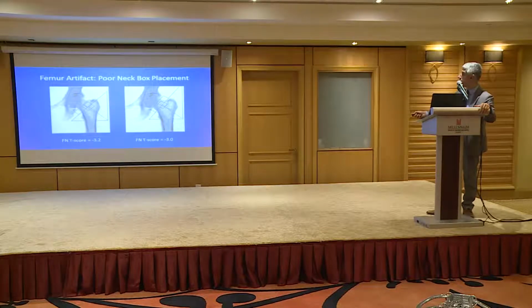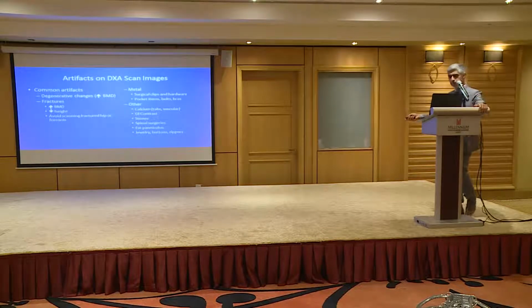This is poor neck box placement. As we mentioned, you can see here it is completely off place. This is corrected. This is not a repeat scan. This is just a repeat analysis. So here, I think this is the last slide.